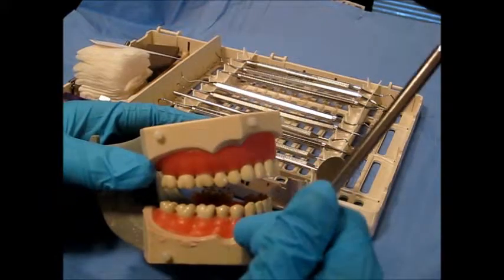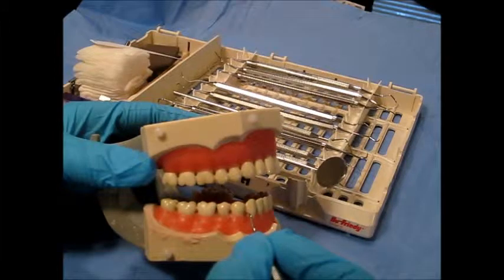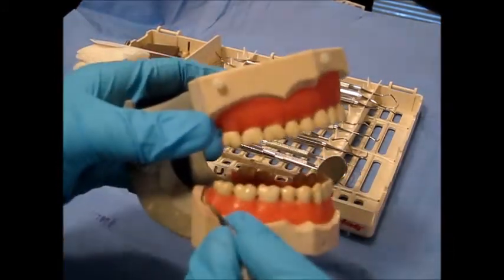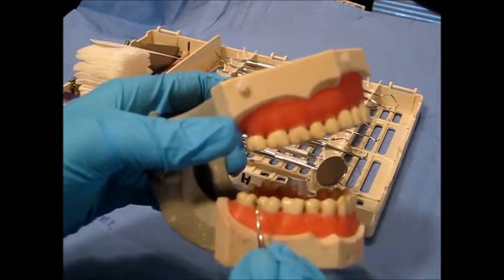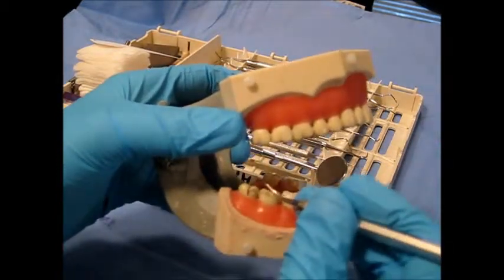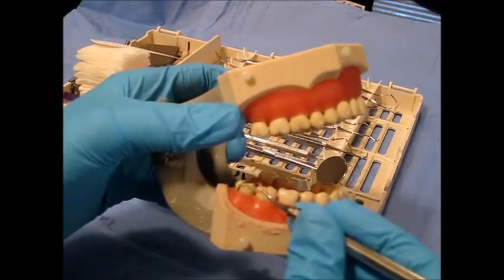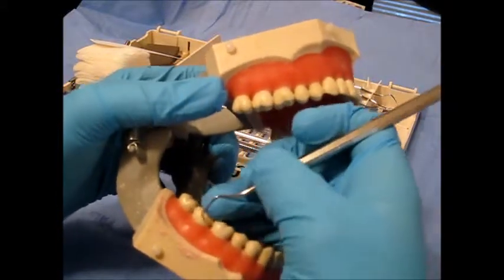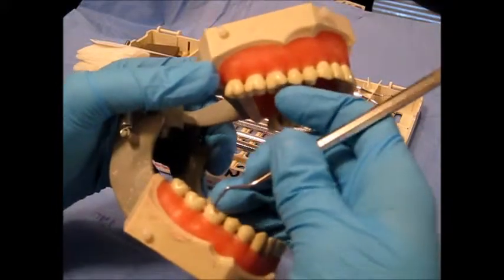This instrument is utilized in the posterior region of the mouth, and is adapted from the distal line angle to the mesial line angle. Moving to the next tooth, we continue distal line angle to mesial line angle throughout the posterior region.